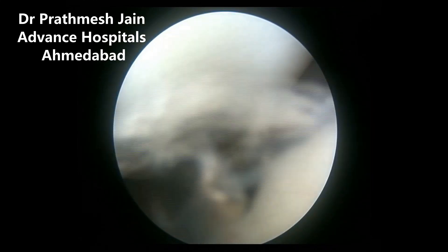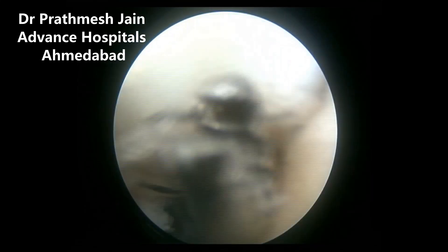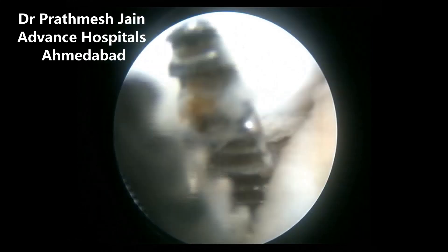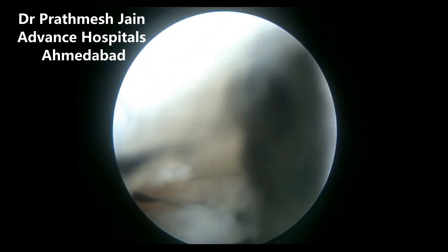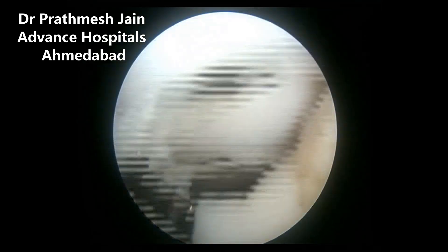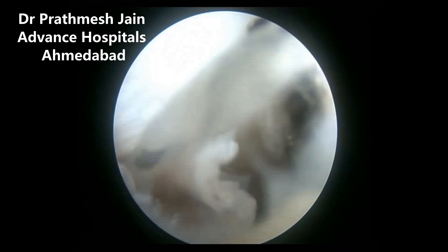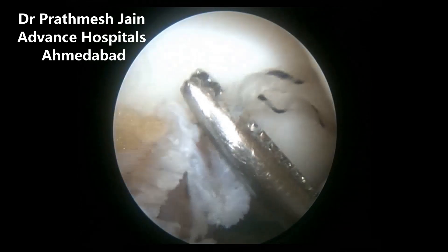After that, we do some suture management and make the graft a little bit lax, then reach the fiber-wire threads on the more distal aspect. Once we do that, we pull it back. Here also we are avoiding making any drill or any tunnels into the femur as well as the tibia.